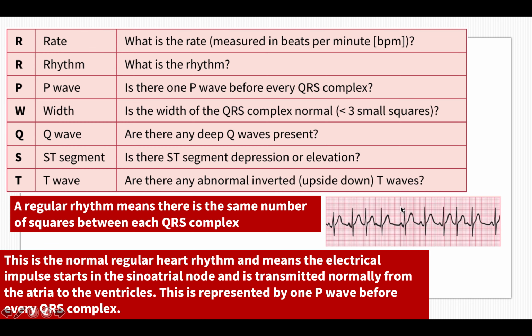So now the main thing I want you to take away from this slide or this video is, each time you look at an ECG, remember the mnemonic RRPWQST. So I have it on the screen now. The R stands for rate and the second R stands for rhythm.